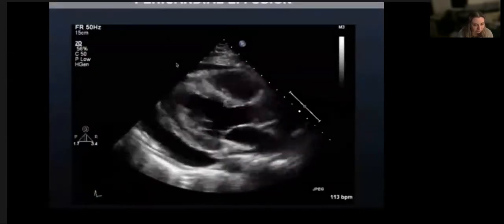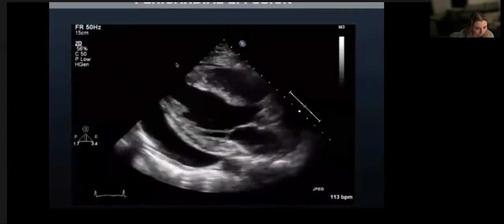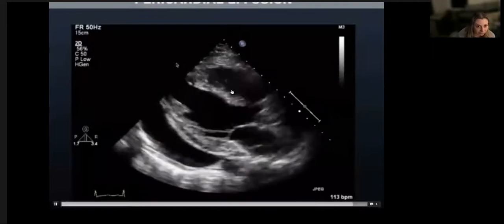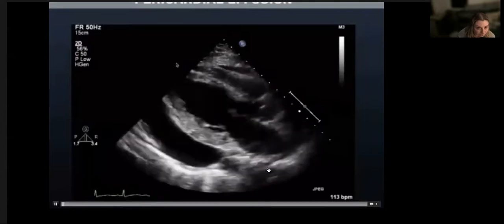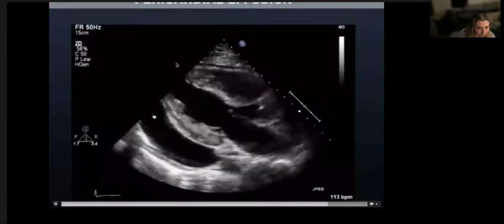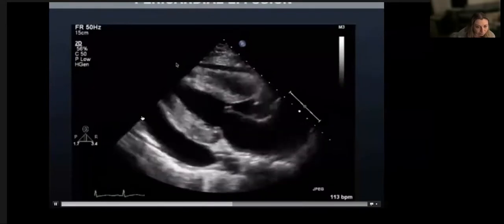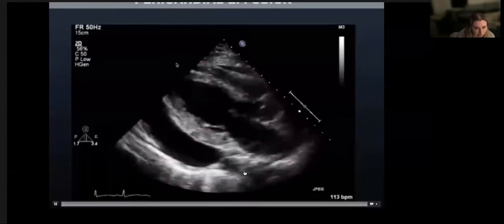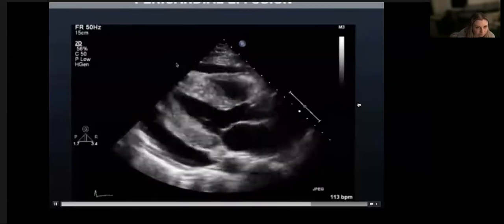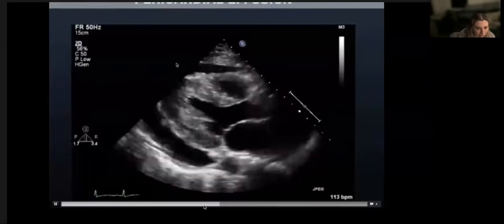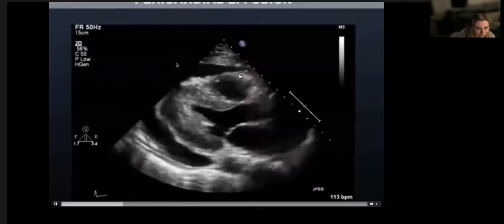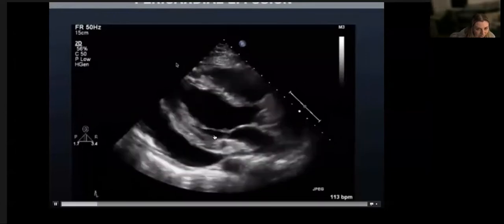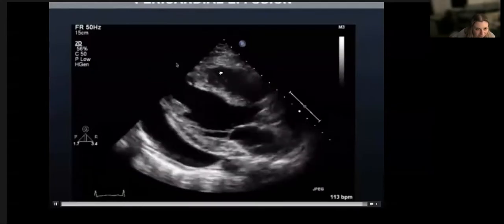Effusions can be pericardial or pleural. Here we have a parasternal long axis view with some fluid around the LV. We have our LV here, our right ventricular outflow tract, and this black anechoic area is fluid. On this view it could be pericardial or pleural. We use the descending aorta as our landmark to differentiate the two. This is a pericardial effusion. You'll see a little bit of bouncing of the free wall of the RVOT, but this is not diastolic collapse.